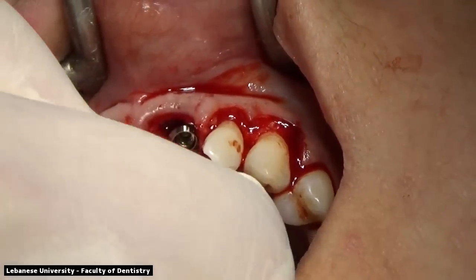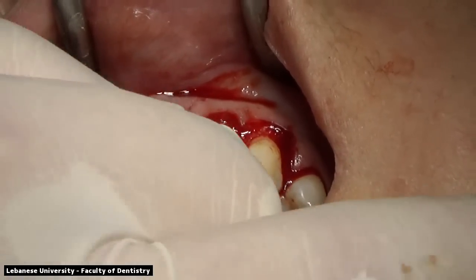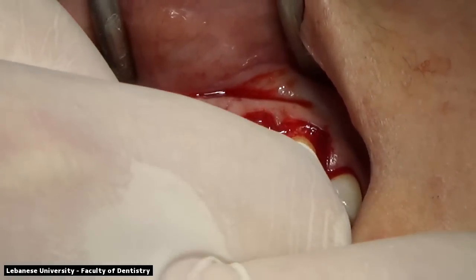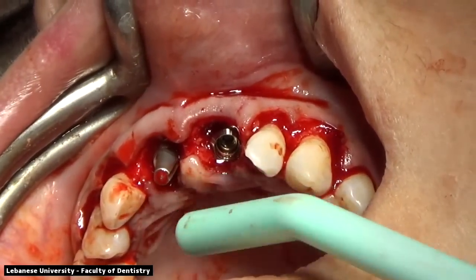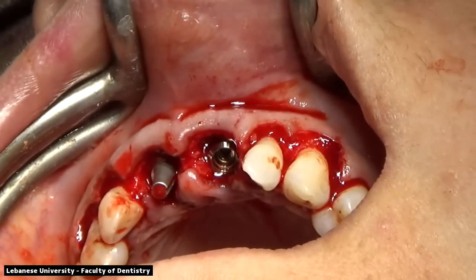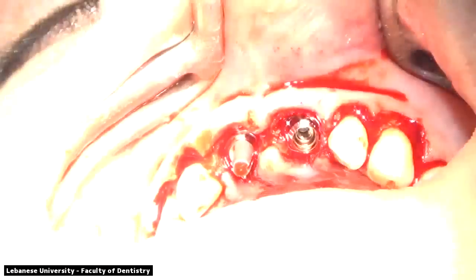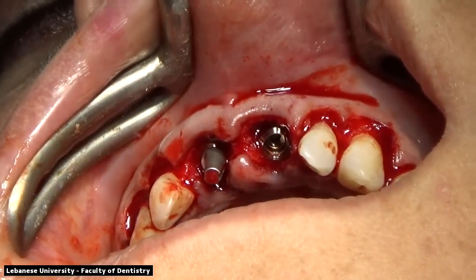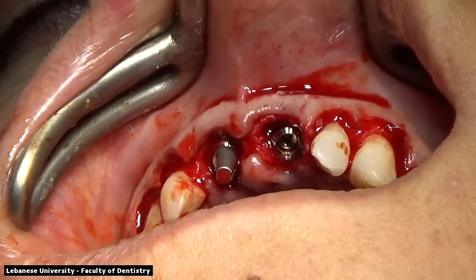After making sure that the bone is sound and there is no granulation tissue left, we used a 2 millimeter twist drill to go to the palatal aspect with the direction of the occlusal surfaces as well. And after placing 2 implants by hand and using the torque wrench to make sure that we have initial stability, we are placing our 2 abutments, which are 5.5 millimeters in diameter. The abutments are being screwed right now to the tissue level implants that we placed. The implants were 3.3 millimeters in diameter and 12 millimeters in length.